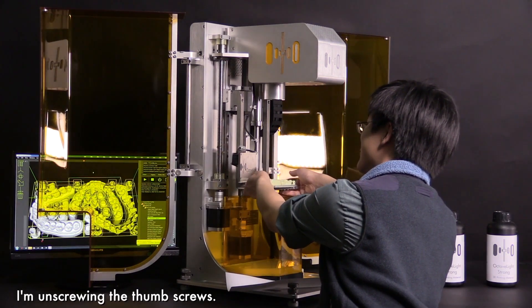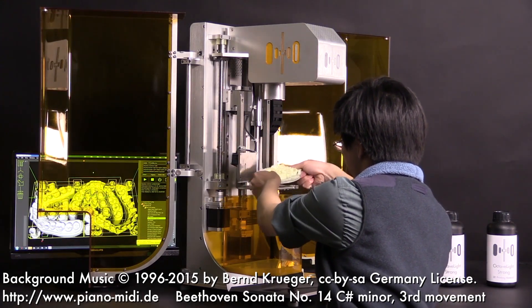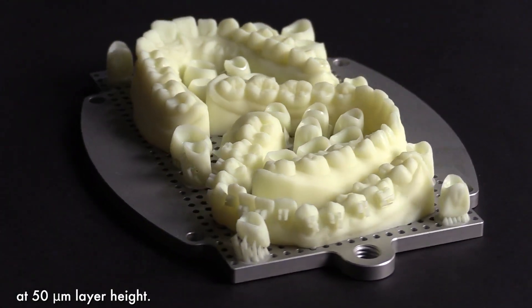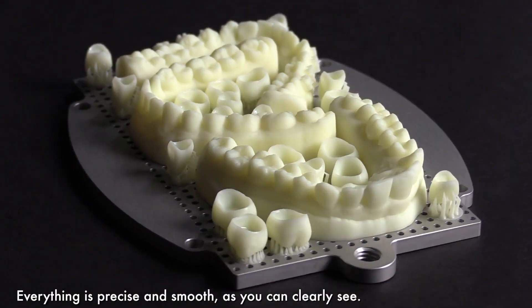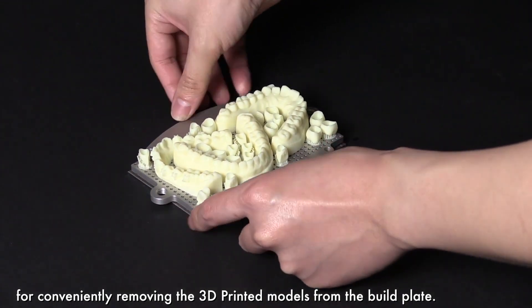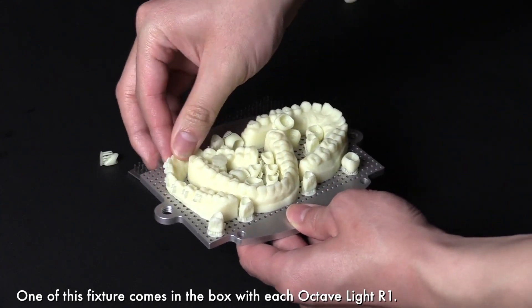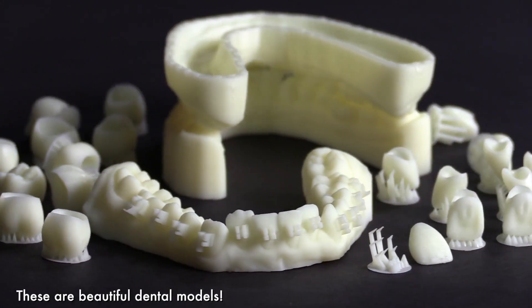In 1 hour and 39 minutes, we have printed 3 dental arches and 21 individual teeth at 50 micrometer layer height — 50 micrometers is half the thickness of a piece of paper. Everything is precise and smooth as you can clearly see. Let me show you the fixture for conveniently removing the 3D printed models from the build plate. This method applies force evenly to preserve the accuracy of the models. One of these fixtures comes in the box with each Octavlite R1. These are beautiful dental models.